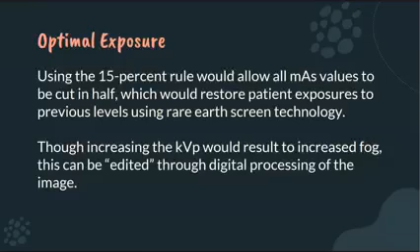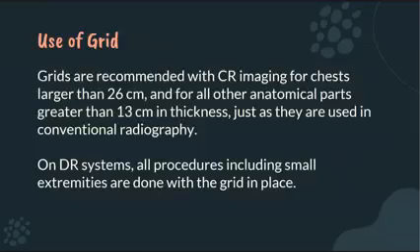So grids are recommended with CR imaging for chests larger than 26 centimeters and for all other anatomic parts greater than 13 centimeters in thickness, just as they are used in conventional radiography. Okay? So there are other books that cite that it is not 13 centimeters in thickness that necessitates the use of grid.